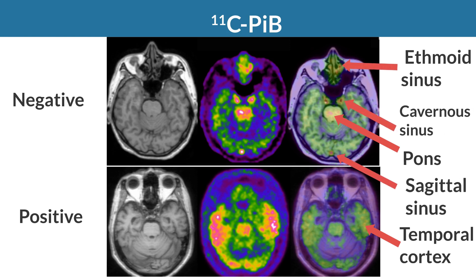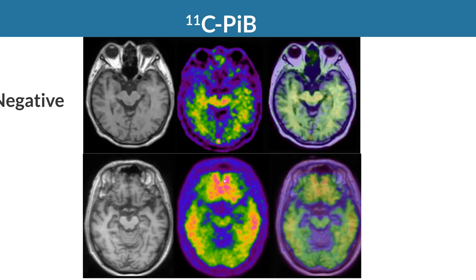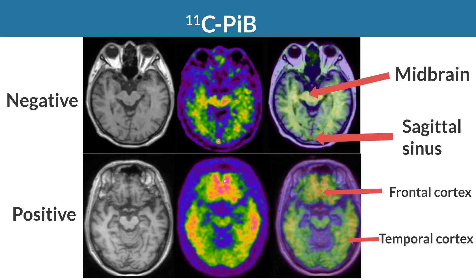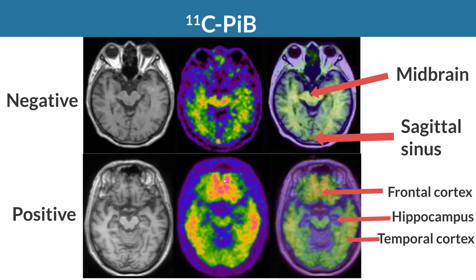High accumulation is observed in the ethmoid sinus, sagittal sinus, and cavernous sinus in a negative case. At the midbrain level, frontal and temporal cortices show high accumulation in a positive case. On the other hand, the hippocampus shows low accumulation in a positive case.